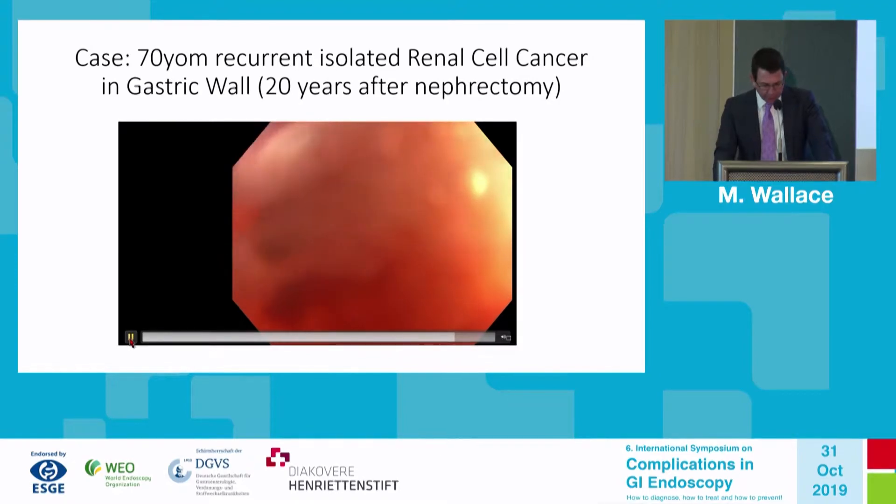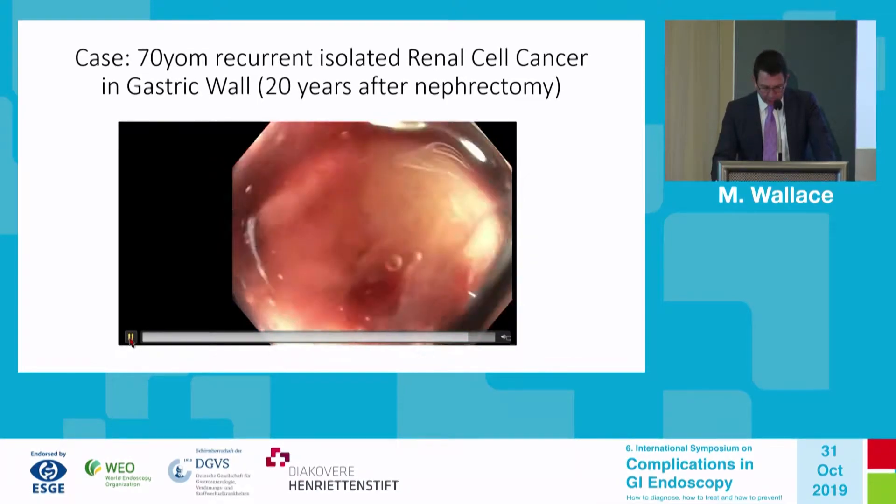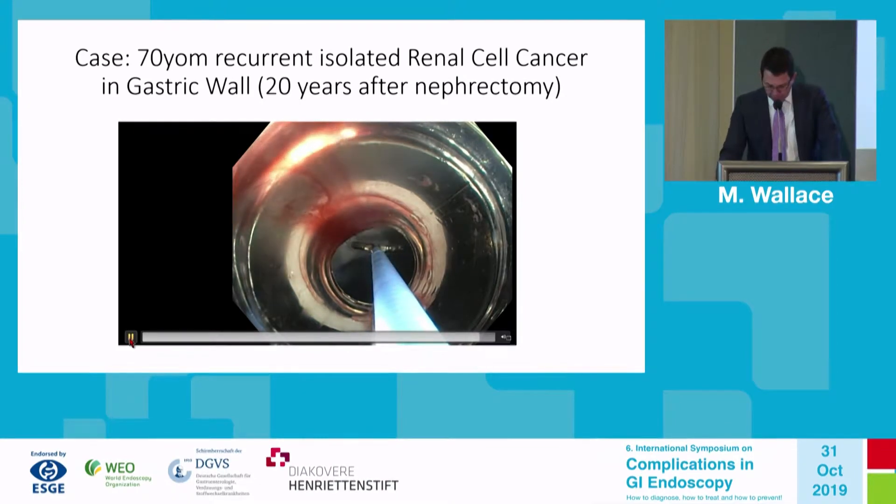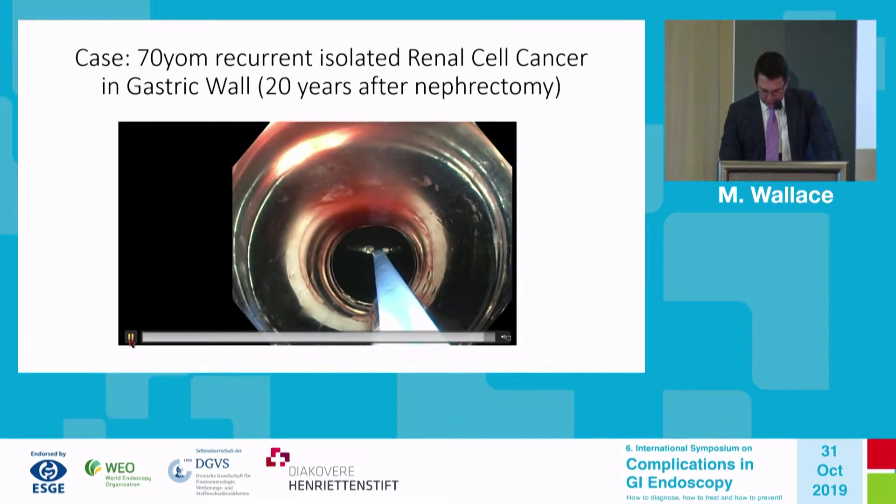We then withdraw the upper endoscope and we release the lesion onto the bedside table. We can make some measurements of the lesion and see that it is, in fact, fully resected.